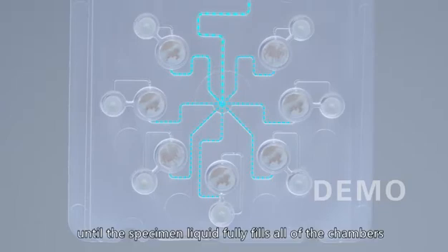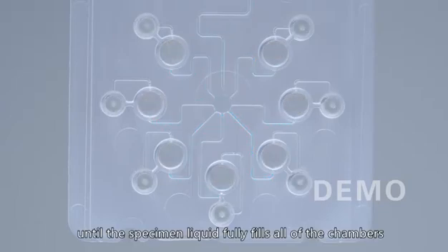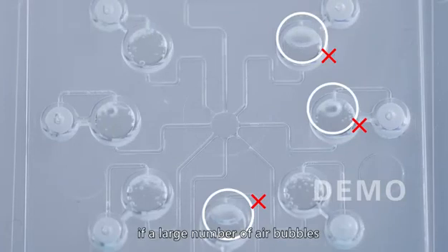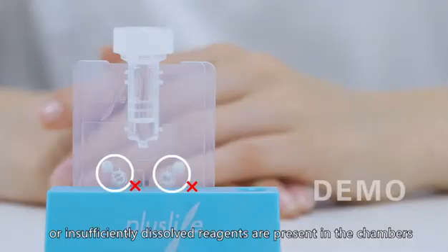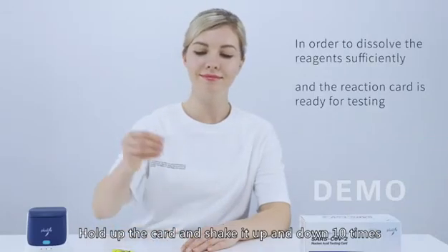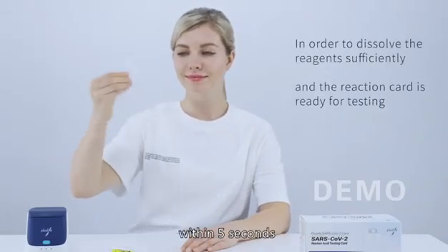Wait 10 seconds until the specimen liquid fully fills all the chambers. Please be aware that invalid results are likely if a large number of air bubbles or insufficiently dissolved reagents are present in the chambers. Then hold up the card and shake it up and down 10 times within 5 seconds.